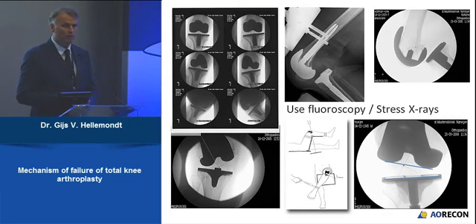And it will give you information whether the lateral collateral is competent and whether the opening on the lateral or medial joint line is too much.